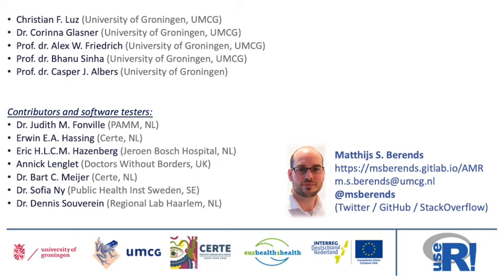There's a lot of people to thank for the development. We couldn't, of course, do this alone. There are software testers from, I believe, 7 different institutes in also different countries, and it was great to work with all those people.